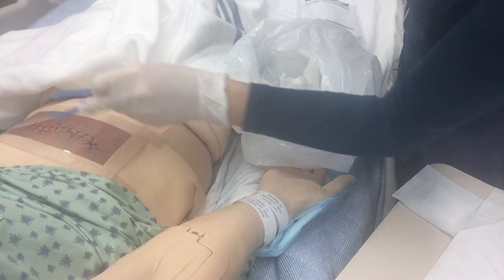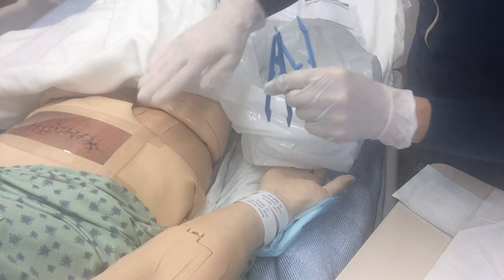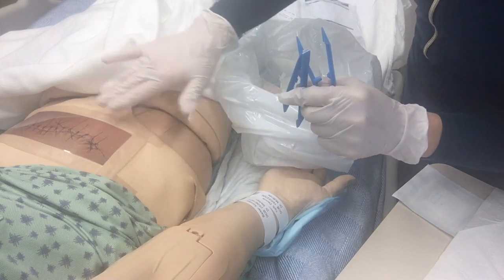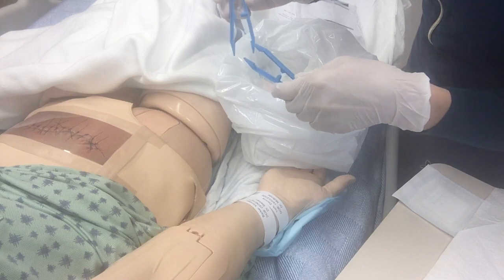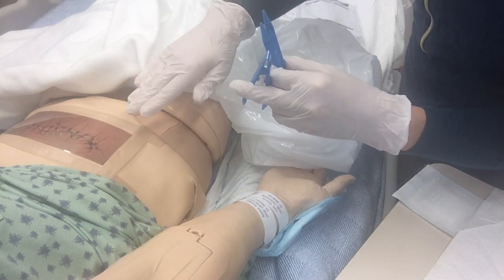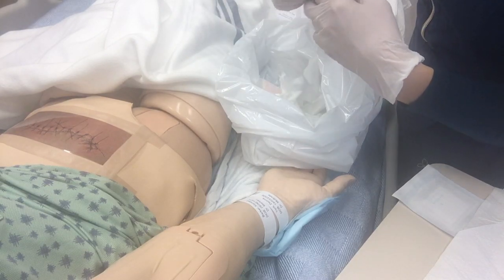I'm also noting what the peri-wound area looks like. Is there swelling? Is it a little bit red? Below the incision, it looks a little bit red, and right on the corner. Noting if it looks macerated, if it looks waterlogged, but I don't see any of that. It actually looks quite well.